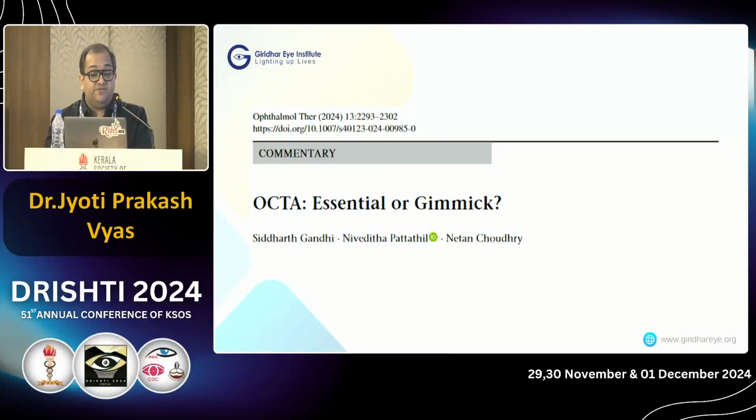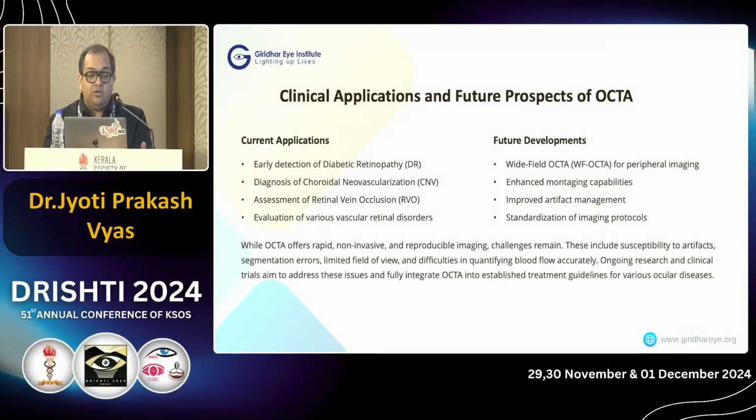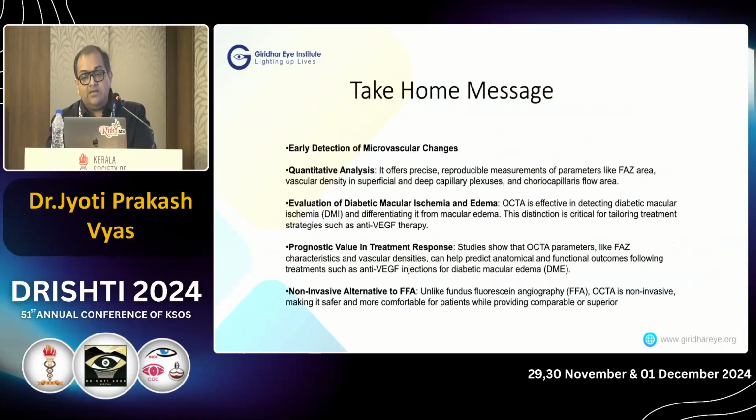So now coming to the first question again, whether it's an essential tool or a gimmick. It's actually the title of another article which was published this year itself, and they found that although the current applications extend extensively to all applications, the main problems are that there are no analytical tools which are stratified, there's no strategy which is fixed across different diseases, and various protocols have to be standardized in order to be used across different institutions and across different trials.